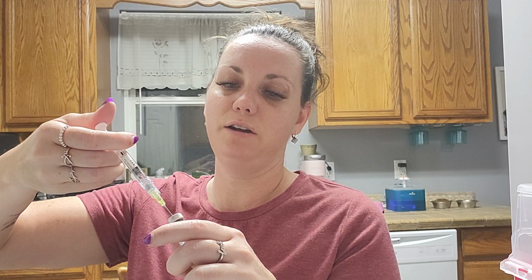Take your vial, pop your top, take the lid off your needle, and inject it into your powder. All of it. Just squeeze it on in there. And then keep your plunger held down like so, and just swirl it around a little bit. You don't want to shake it, right? Because you don't want to get any air bubbles in there. Remember, this is going to be going into your body. So just swirl it around like this for a couple of seconds, and this is what the instruction insert will tell you to do as well.